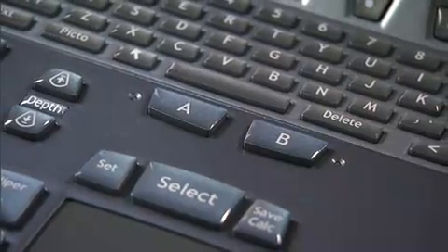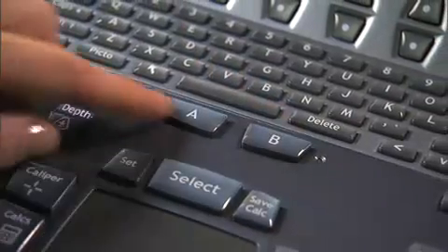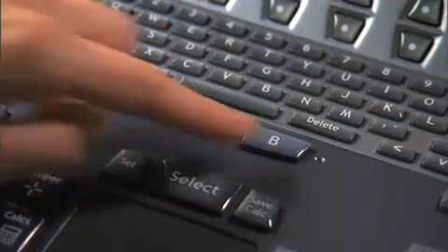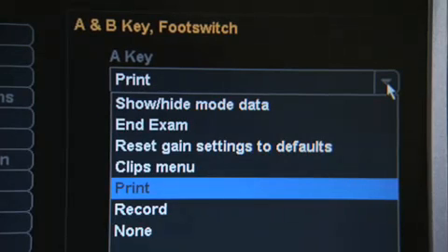Above the touchpad are two shortcut or programmable keys, A and B. You may choose a function for each in the setup menu. The default value for A is Print and for B is Record. You may assign other functions to these keys, including show or hide mode data, end exam, reset gain settings to defaults, clips menu, print, record, or none.